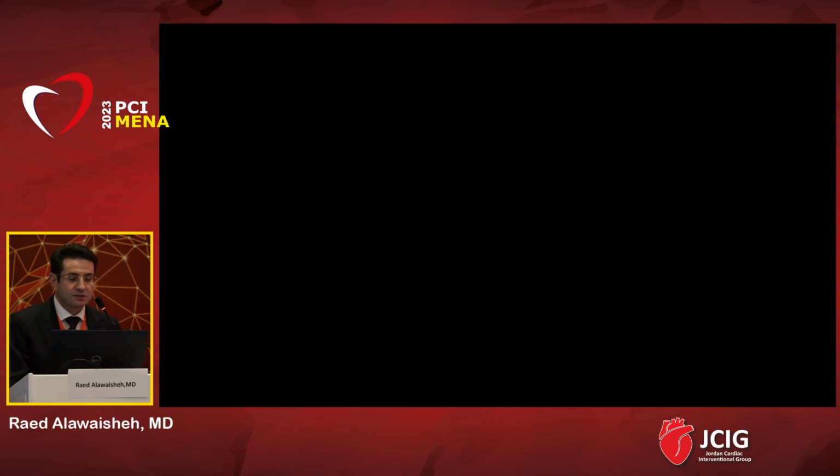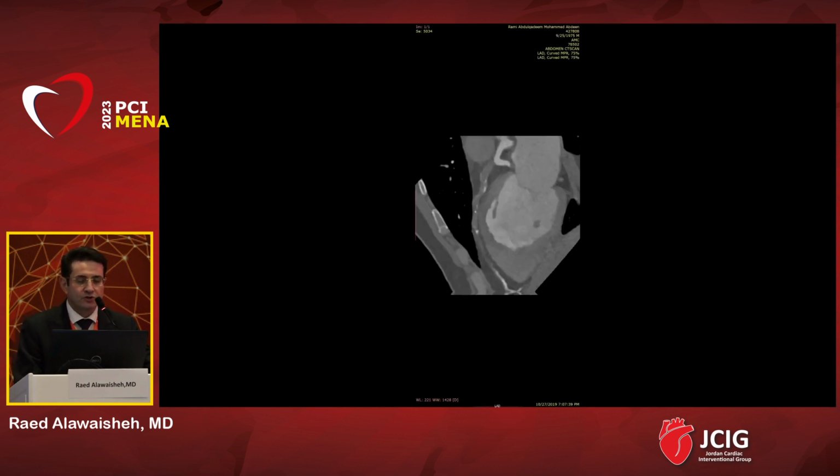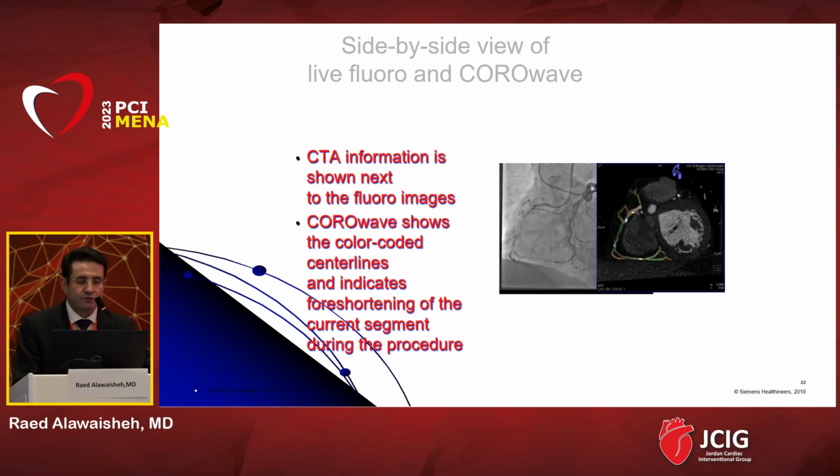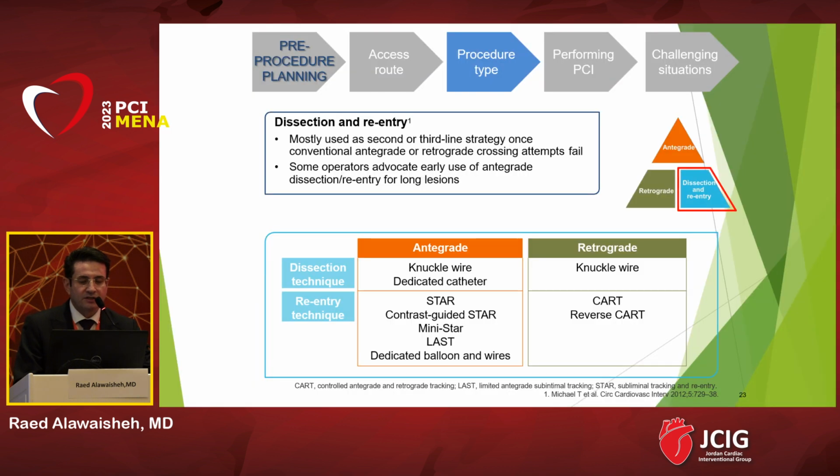Unfortunately, something happened, as we did not give general anesthesia for this patient, and he pulled everything out. So I regret that, and we stopped. We did not continue with the retrograde. I decided the next time to do a CT and find out why the LAD was not easy in the antegrade.